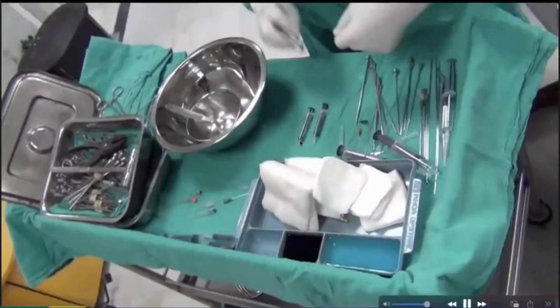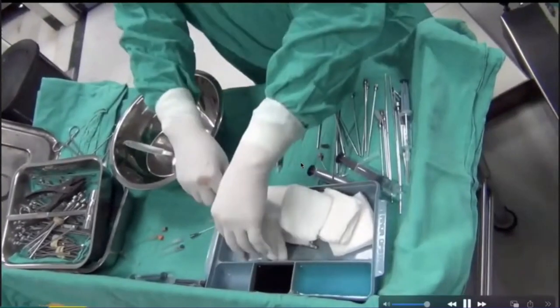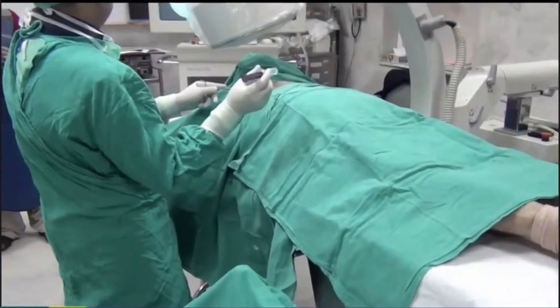I use 2 ml syringes because I want to inject small volumes at one time. If you inject a larger volume, the chances of leakage are very high. In kyphoplasty, yes, you can take a bigger 5 ml syringe for loading.